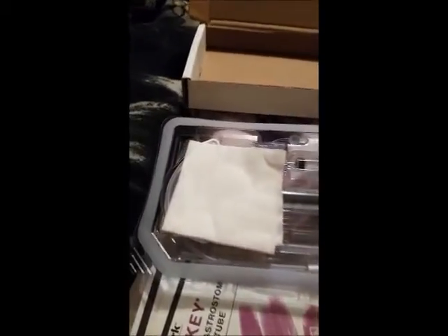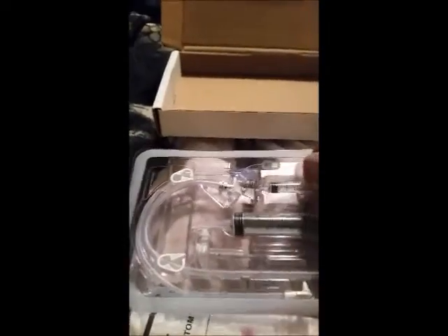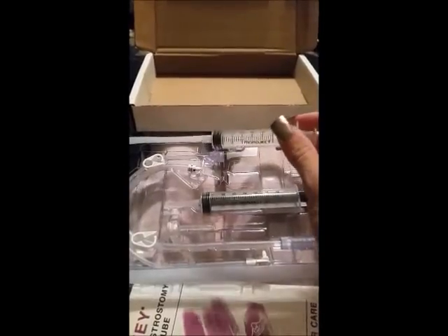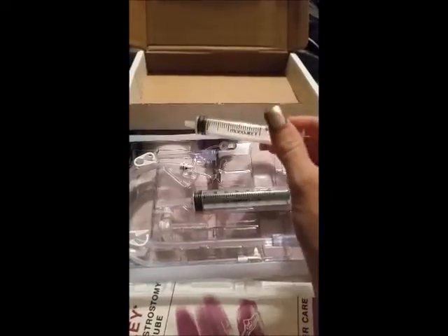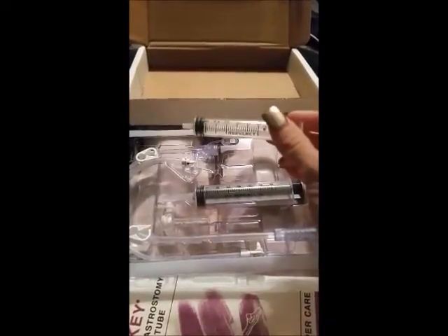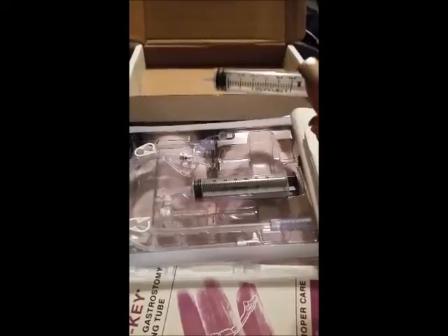I've been doing this a long time, so I just do it my way, and it's worked for me for years. And my doctors are always impressed with how my feeding tube site looks, so I think I'm doing a good job. Normally, I would have 2 of these. One to pull out the old, if there's any fluid left in the balloon of the button. But I'm going to have to kind of wing this and just rinse it when I'm done, because I don't have the extra one because I'm at my boyfriend's house. And the last time I changed my feeding tube was months ago at my parents', and I'm long overdue, as I said.